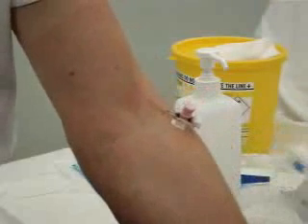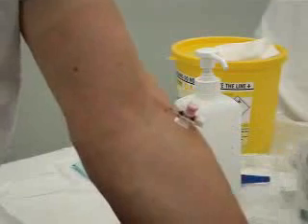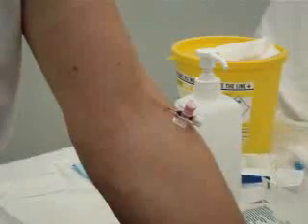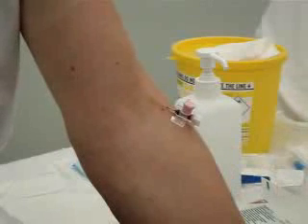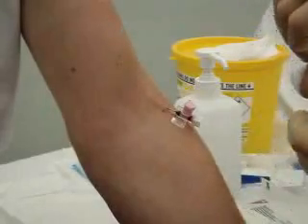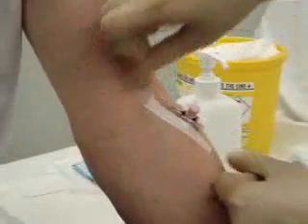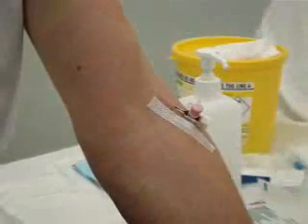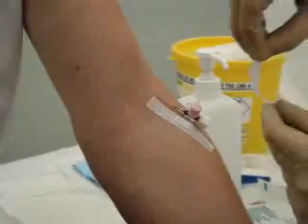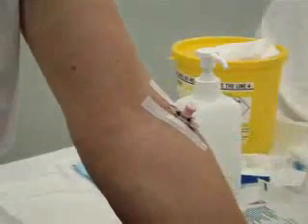What remains left to do now is to put a cannula dressing over the top, and these come by lots of different names, terms such as a Decafix, but these are very simple. This is the one that we use locally. It comes with two strips which you place down the side of each of the wings of the cannula, if you like. So one strip just there, one strip just here.